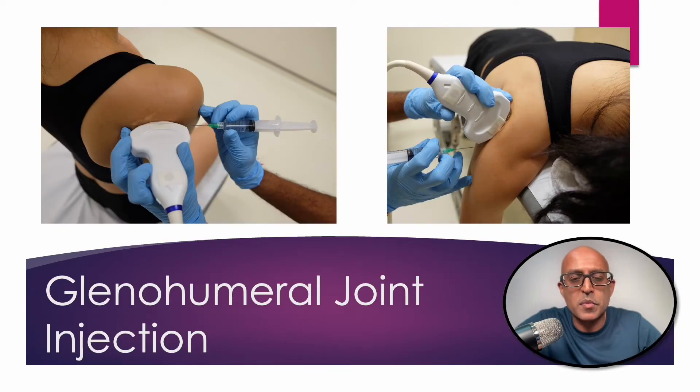Irrespective of whether the patient is sitting upright or lying prone, I would suggest you approach the injection from a lateral to medial orientation. This means that you can use the humeral head to help guide the needle into the glenohumeral joint, and it also means that it remains a lot more stable throughout the procedure.